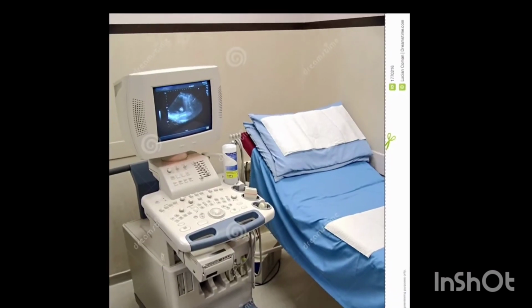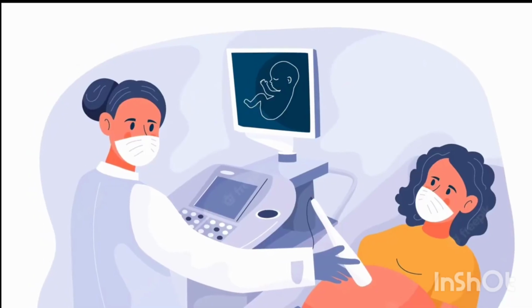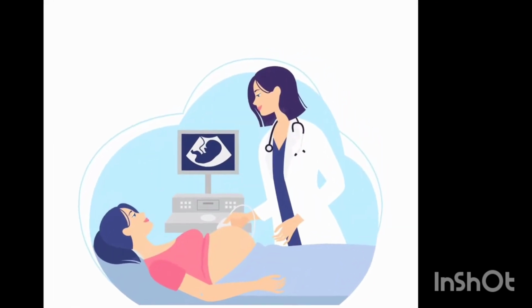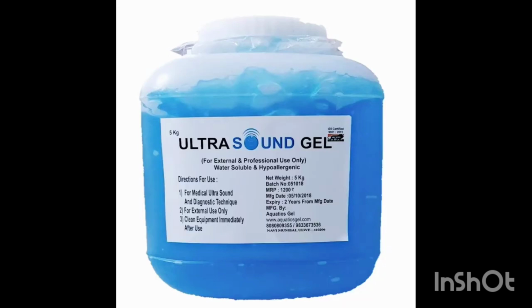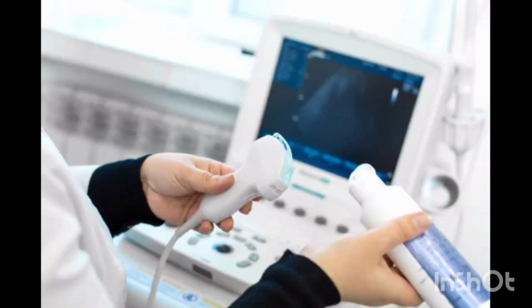A good knowledge of ultrasound will begin with the least unexpected aspects, as in receiving a patient. Greet the patient, introduce yourself, make the patient feel relaxed, and ask opening questions. Direct the patient to an ultrasound examination bed, and set the gel, the liquid used to fill the gap between the skin and the ultrasound transducer, so that there is no intervening air to interfere with ultrasound transmission.